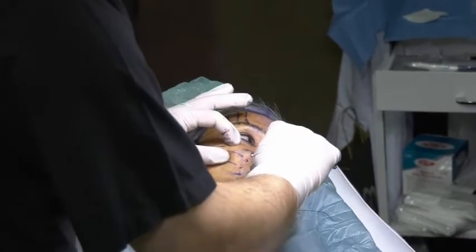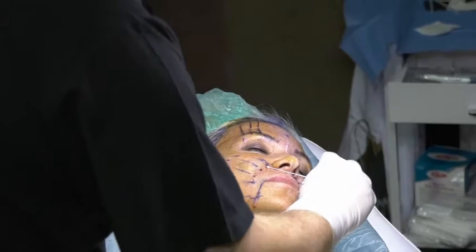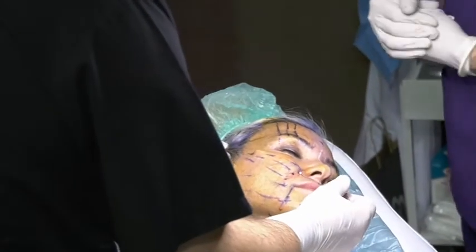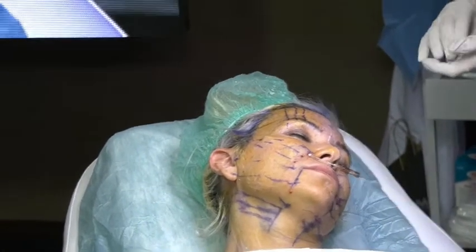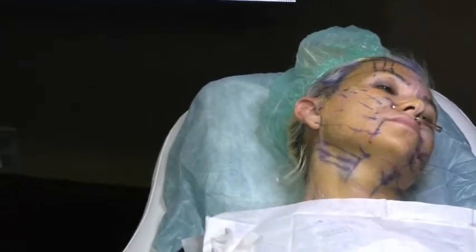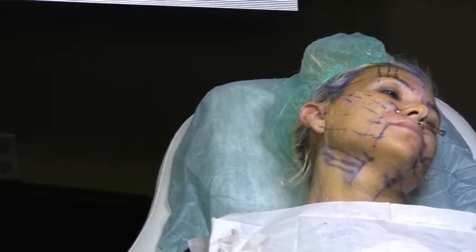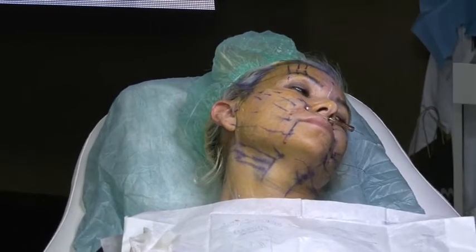Then again, lift up, collect the skin and push. Again, and push. You see here? Do you like this last drive of mine? The needle now, the position of the needle. You like it? I don't like it. Why? It looks superficial. What do I have to do? No. Hold the back of the thread and go a little bit back.